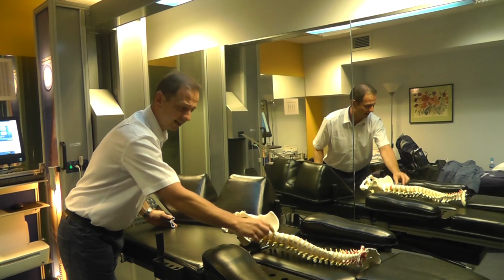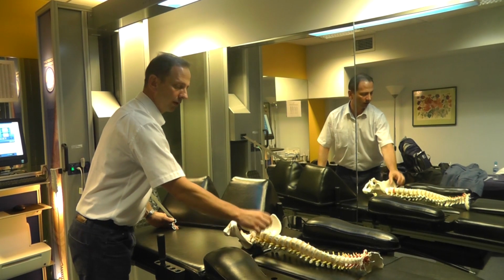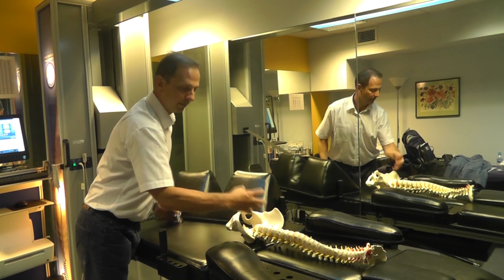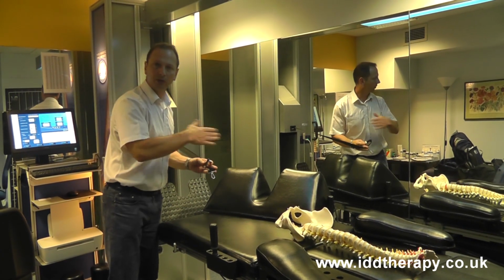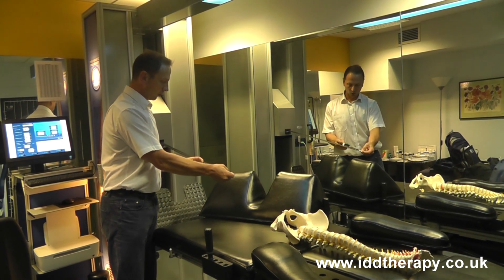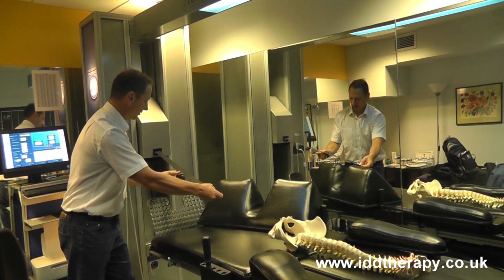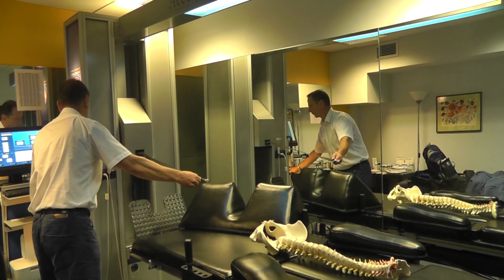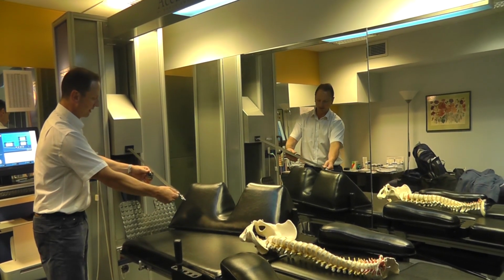Not 100% at a particular level, but a difference of 5 degrees can make a massive difference to where the force is working and how we can open specific spinal segments. So we're going to be opening and then mobilizing. Once we have the patient in position, you have people who are different lengths, obviously, and different sizes. So depending on the height of the patient, we can adjust this angle using an inclinometer. Some clinics will use an app on their phone, and I can move this. I'm just adjusting this depending on where 15 degrees is.